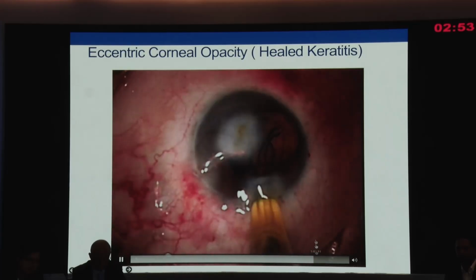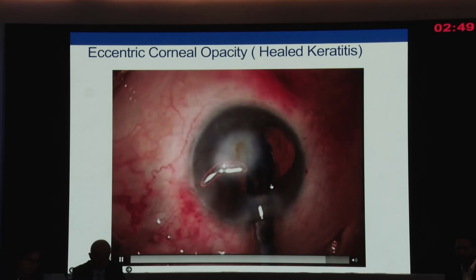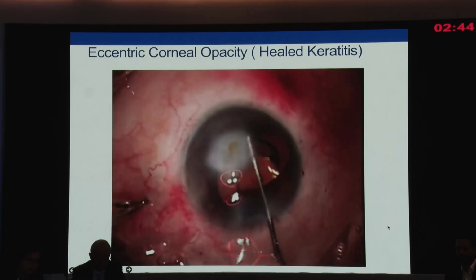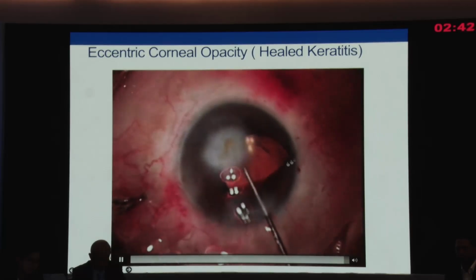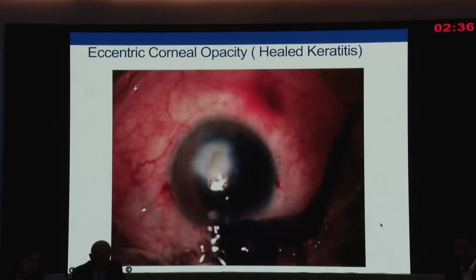And then sometimes, like I said, when you start to put the lens, you can actually see the edge of the rhexis there, and then place the lens inside as well. With the Care Group company now, we are working also with the intraocular lens with asymmetric haptics, because especially in optical iridectomy cases where you don't plan corneal transplants.